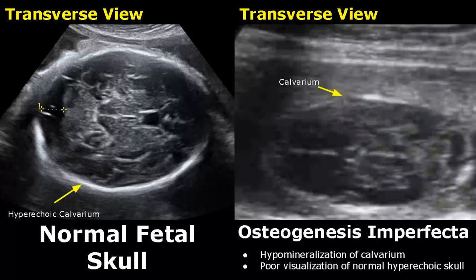In a fetus with osteogenesis imperfecta, hypomineralization of the calvarium occurs. We do not see the normal hyperechoic skull here, because the mineralization of the calvarium is not adequate.